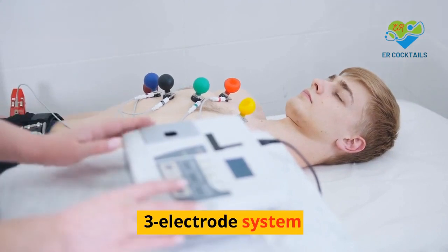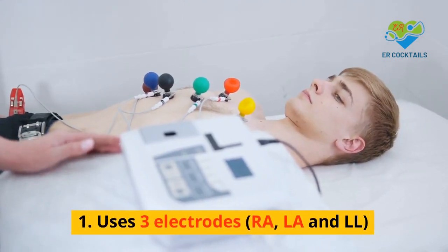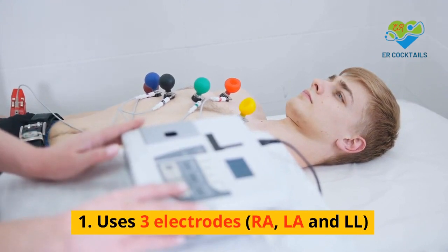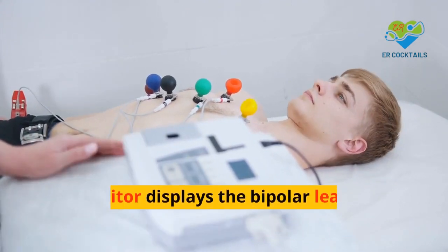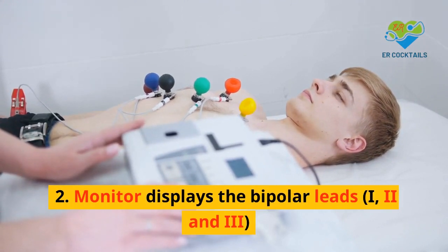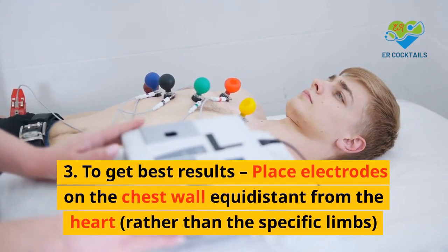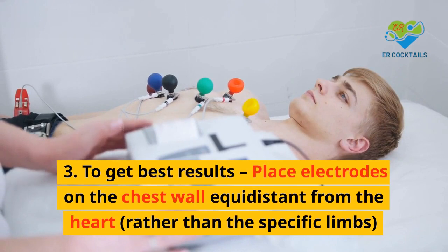3-electrode system. 1. Uses 3 electrodes: RA, LA and LL. 2. The monitor displays the bipolar leads I, II and III. 3. To get best results, place electrodes on the chest wall equidistant from the heart, rather than on the specific limbs.